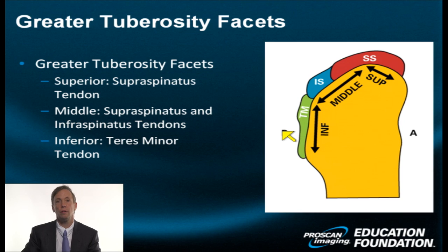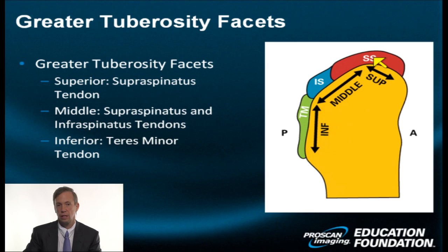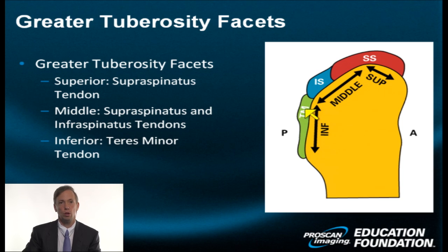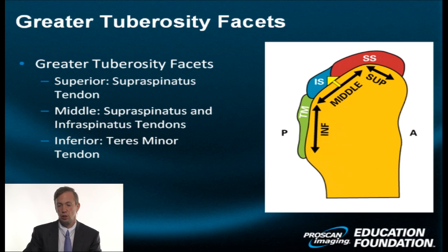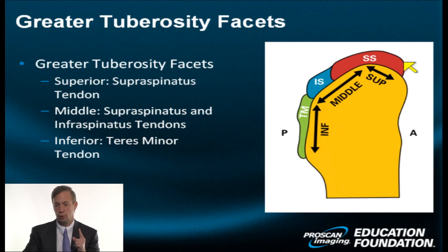We see the supraspinatus (SS) in red, the infraspinatus in blue, and the teres minor in green — only three components of the multifaceted rotator cuff complex. The supraspinatus is more anterior, the infraspinatus more posterior, and the teres minor posterior-inferior. Their footprints are on the superior, middle, and inferior facets of the humerus.